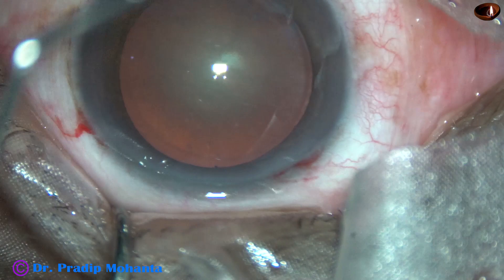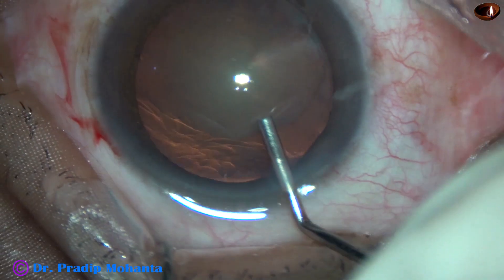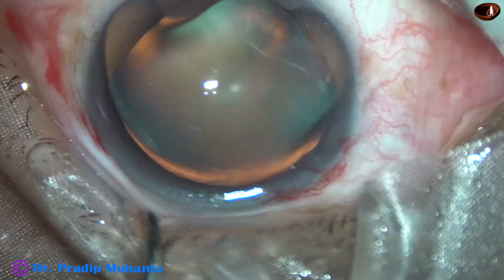By this time, the main incision and side port has been made. This is 2% HPMC filling up the anterior chamber. HPMC is applied over the corneal epithelium for better visibility.